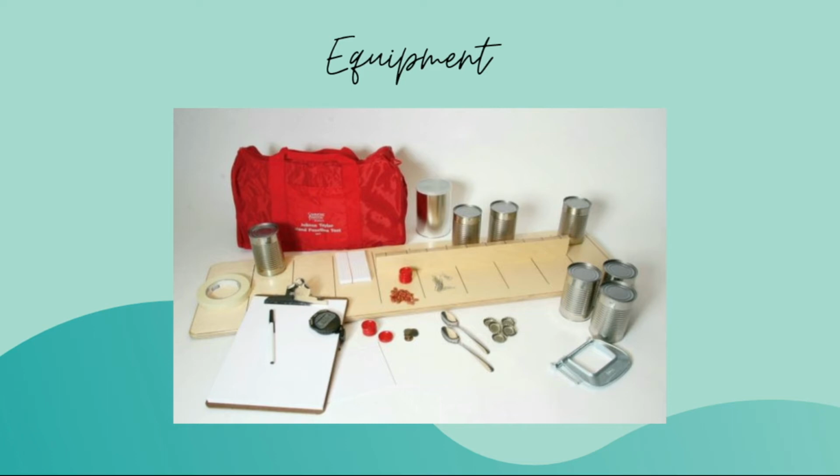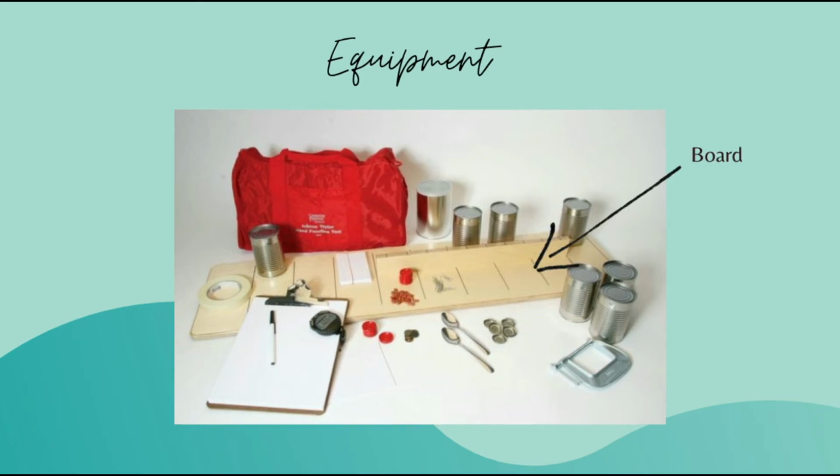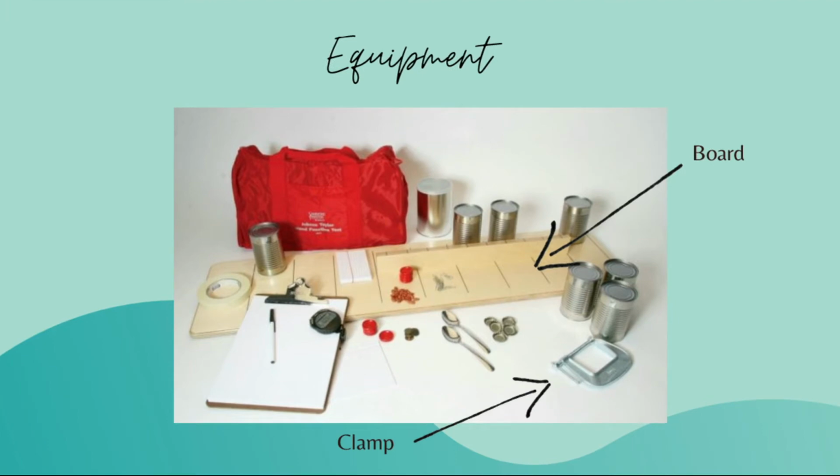The chopping board, for example, looks like this. The lines on the board are spaced 2 inches apart to assist with spacing of the equipment, such as in the simulated page turning subtest, where the flashcards are separated approximately 2 inches apart. The board has a backing that is useful for the simulated feeding subtest, where the participant can use the upright of the board to assist with picking up the beans. The board is also to be clamped to the table so that it does not move during each test. Here are some demonstrations of how each subtest is completed.